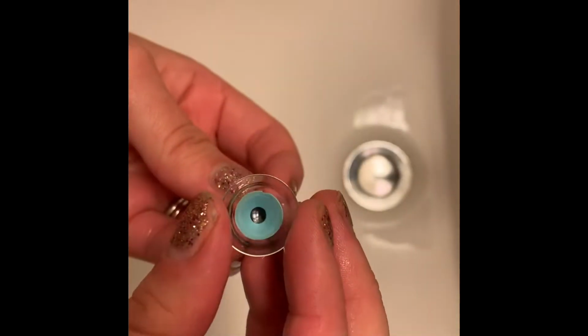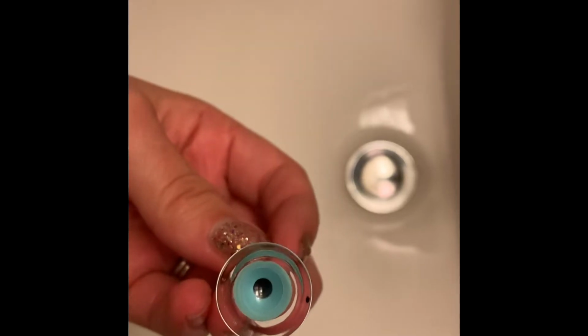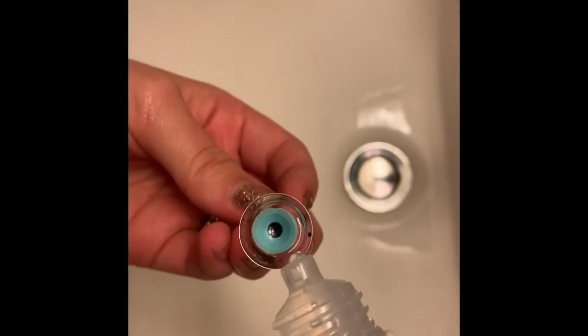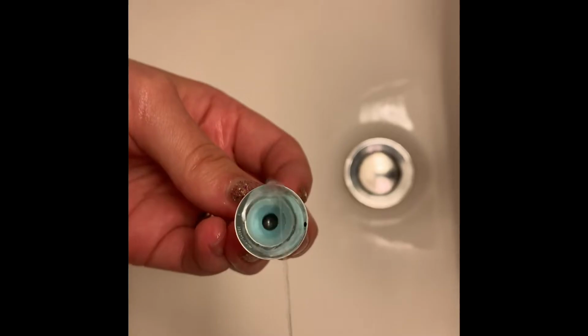Next, you want to place your nice and clean lens on your applicator if you have one. Some people are fancy and they can put them in their eyes without one, and I am not one of those people. Then you want to fill her up. You want to make sure that your lens has enough fluid. You want to overfill it, because if it doesn't have enough solution in it, it's going to cause air bubbles, and that's very uncomfortable.